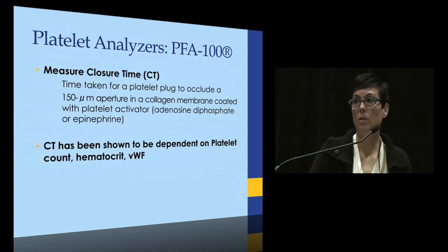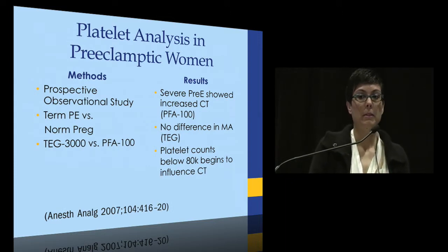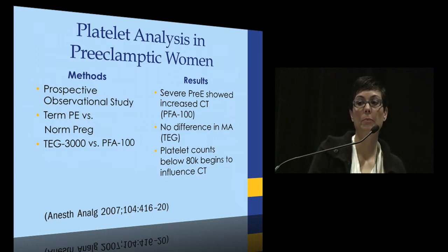So how does this do with our standard TEG and looking at the maximal amplitude? It was a prospective observational study, and again, they did term preeclamptics, so they were not preterm preeclamptics. They had them versus the normal pregnancy patients. Those are the TEG 3000 versus the PFA-100.